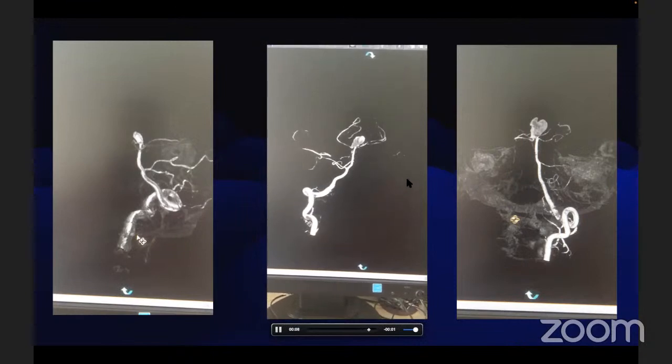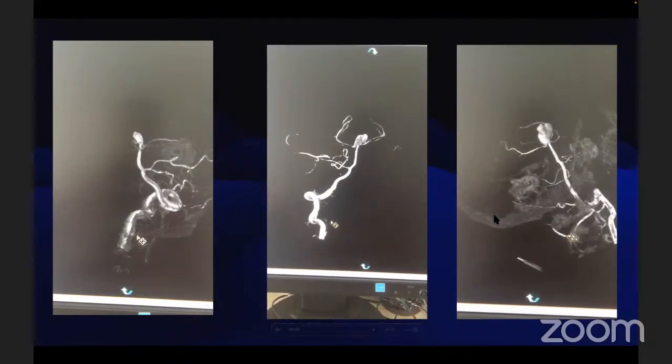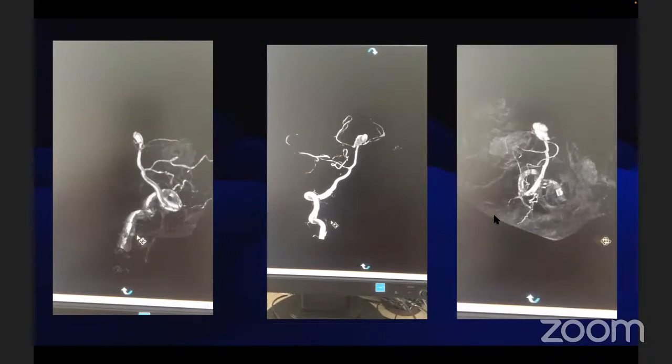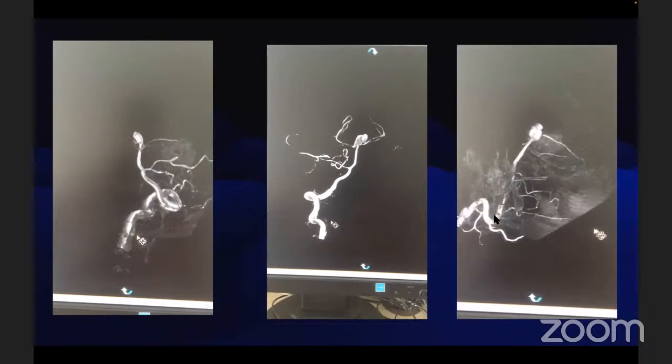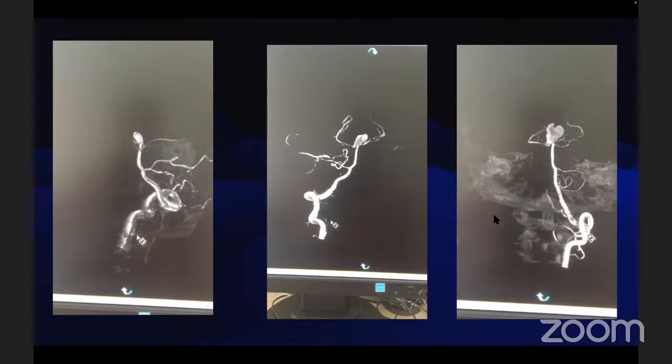Yes. Even in the next angiograph, if there is a forward pushing of the coils, there is always space to place an intrasaccular device, or you could have done stent assisted coiling also, because the results of stent assisted coiling and putting an intrasaccular device are almost similar in reocclusion rate.